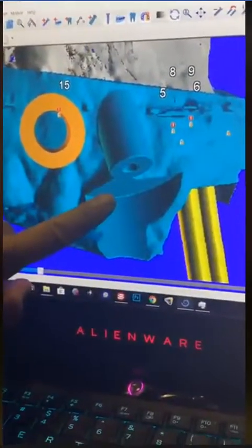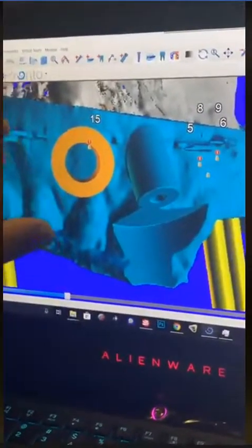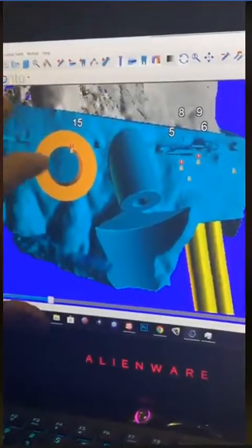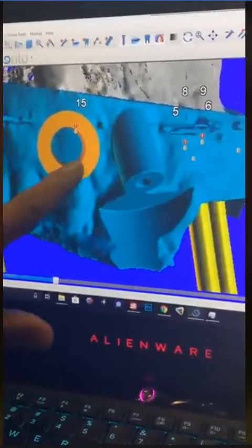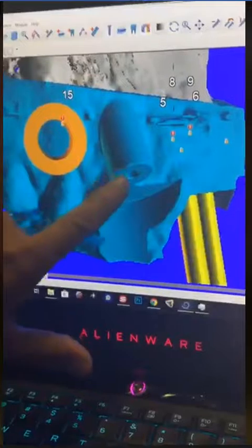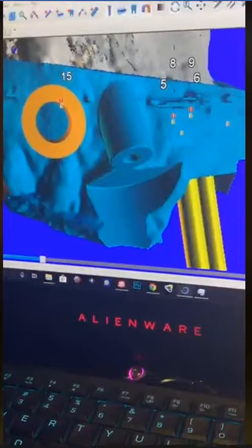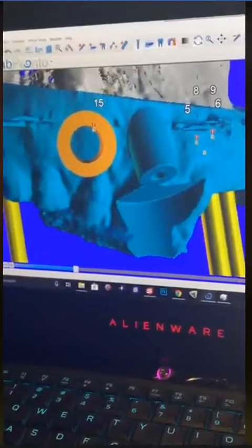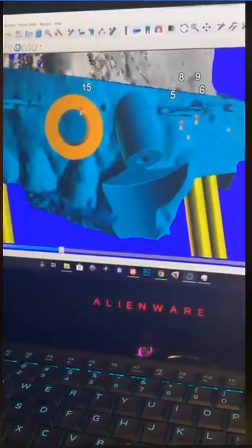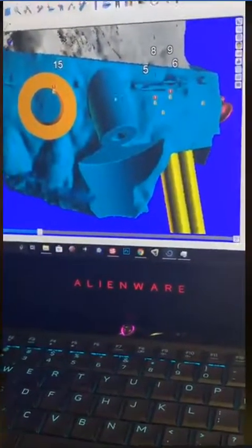I'm gonna show you a photograph of what we did yesterday. In this particular case, this is in there, it's glued in there, and now you have to worry about another part coming down. Maybe the glue didn't work so well and things like that. So what I like to do in this particular case is, I like to go ahead and reduce this size, make it longer. That's gonna hug my guide, my pin all the way, and make it smaller, so this way the pin will actually go ahead and intimately go in there into the bone. Okay, so that's what we do with the fixation pin on this particular case.